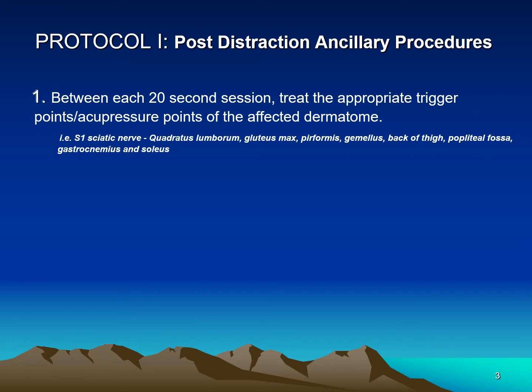All right, so we mentioned that Protocol 1 consists of 3 20-second decompressions. Between those decompression sessions, the patient will likely need just a little break. Even though you're doing the procedure to their tolerance level, they're still in a lot of pain and you're still stirring the pot, even though you're within their tolerable range. It's good to give them a minute or 2 or 3 minutes to rebound from the decompression.